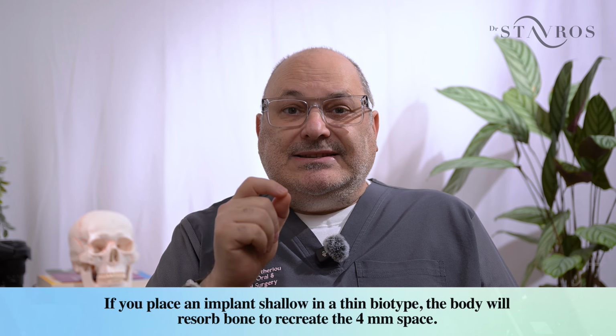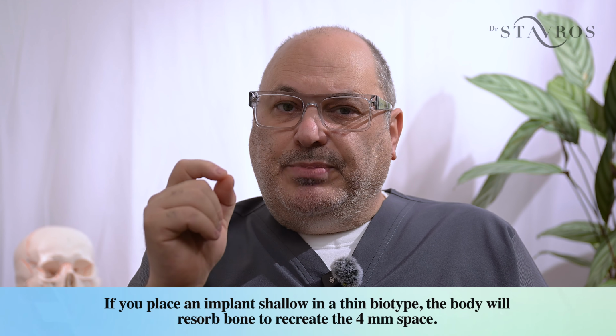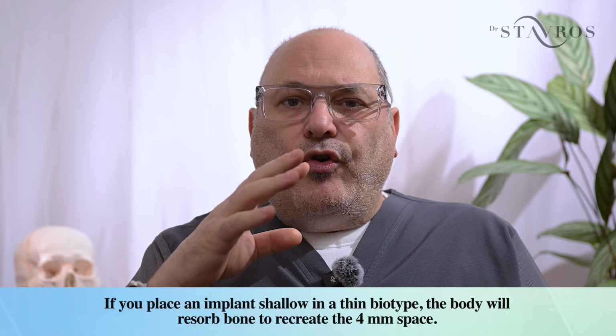If you place an implant shallow in a thin biotype, the body will resorb bone to recreate this 4 millimeter space. If you bury too deep in thick tissue, the excess sulcus invites inflammation and maintenance issues. The goal is constant. From implant abutment junction to the soft tissue zenith, maintain about 4 millimeters. That's the biologic comfort zone. Bone remains stable, the soft tissue matures properly, and your prosthetic emergence profile remains predictable.